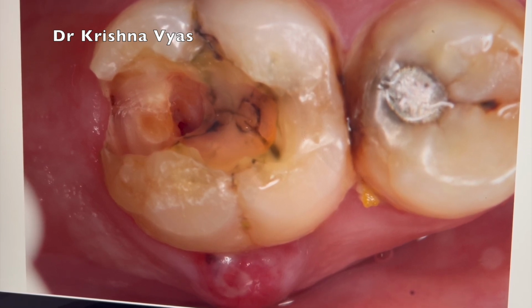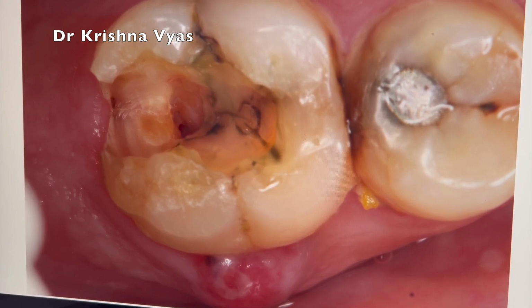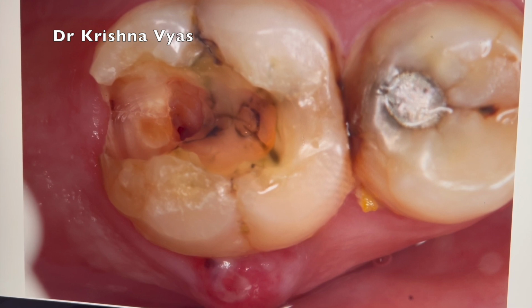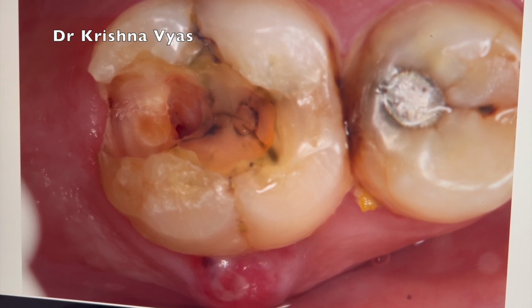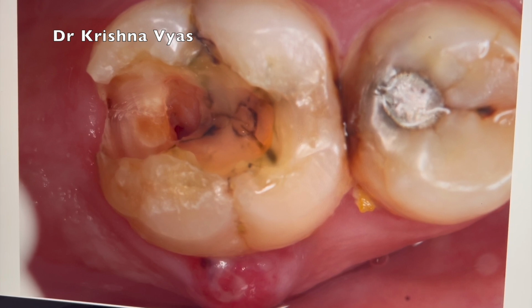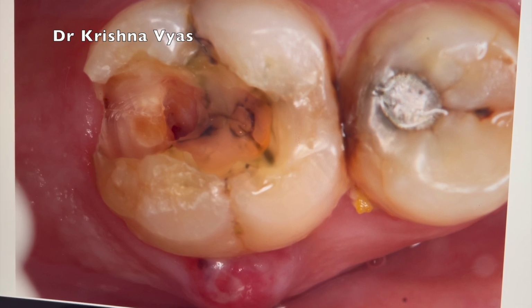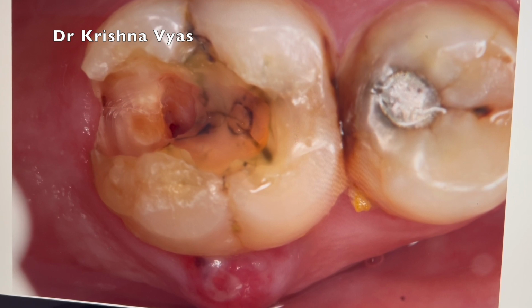So I tell the patient that first let us start with the caries excavation and the crack dissection, and then let us see whether it is going to the root or not. If in case it is going to the root, we will know only when we do the access cavity preparation. If it is going into the root, then the tooth requires extraction. If it is limited to the crown portion, or even superficial to the CEJ, then still it can be preserved with the root canal treatment.